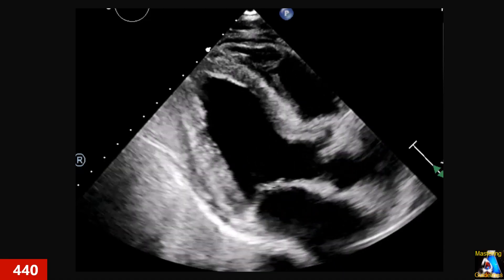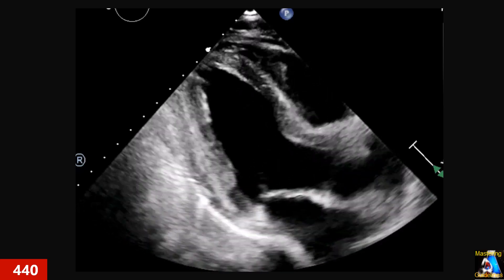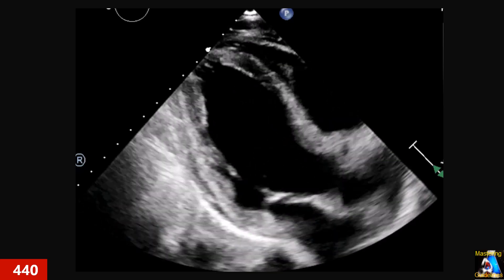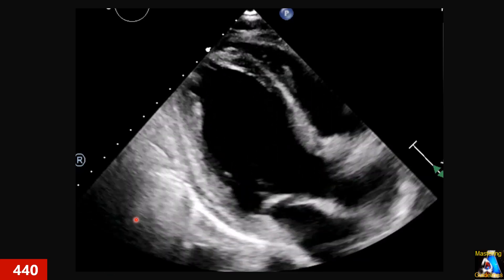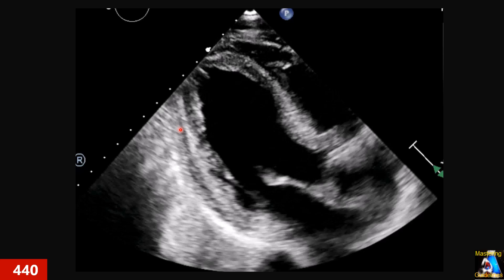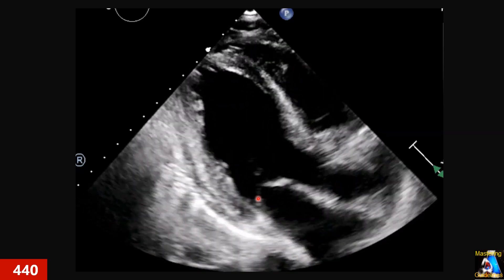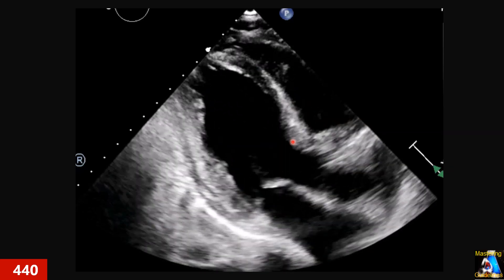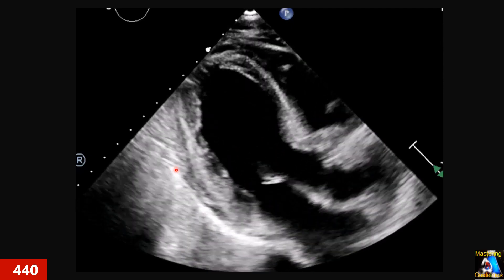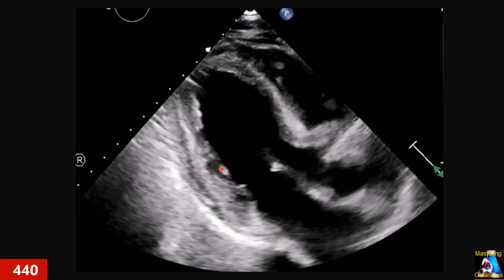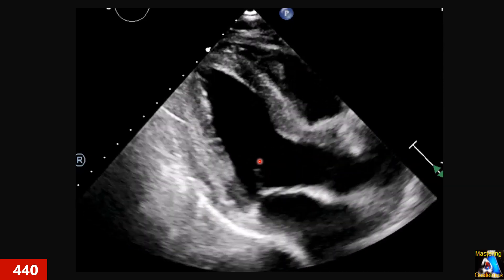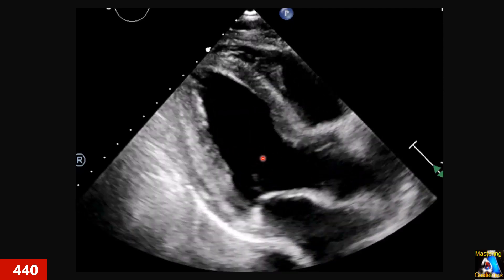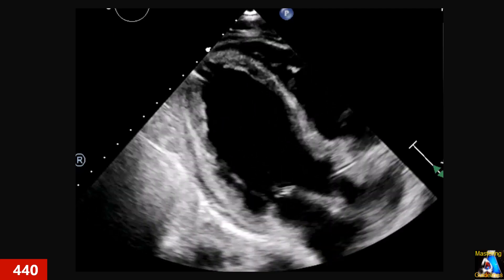In those cases where we don't have a parasternal window — left parasternal long axis and short axis — can we use the parasternal long axis or apical three-chamber view for measurement of LV walls and diameter? What about subcostal? What do we have to consider in those cases, and should we use those views in that situation? Now let's go through them one by one.